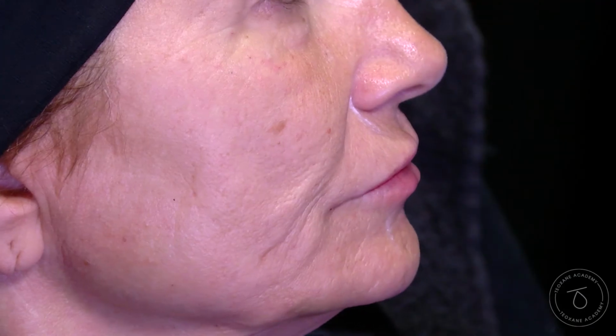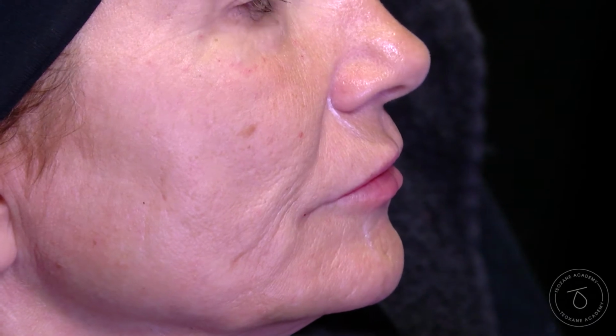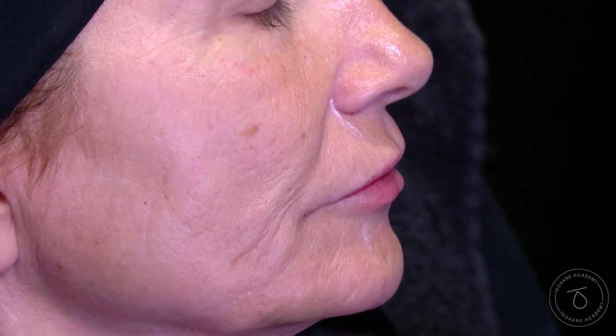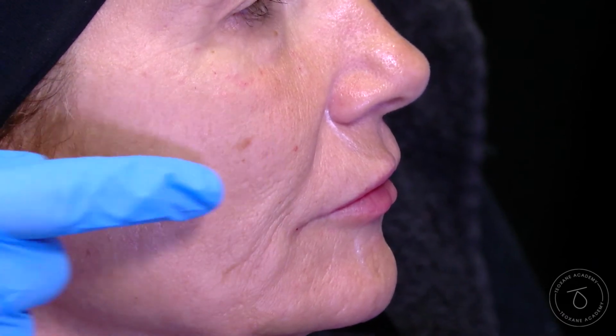Yeah. If we can just swap to this treated side, thank you very much. You can see that there's this much better definition and projection there of the GK point, and all of her lower third just looks more in harmony and balance here.